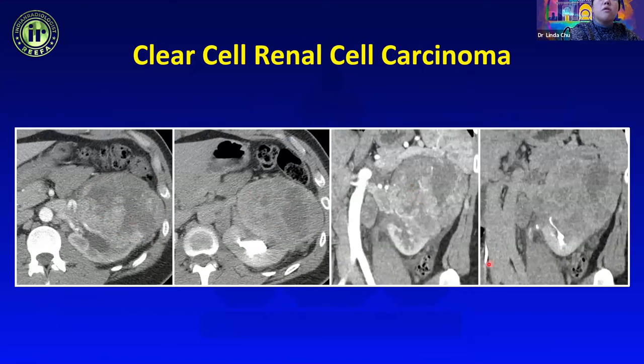Another case demonstrates primarily a peri-renal growth infiltration pattern, and a further case shows bilateral involvement with extensive peri-renal growth and soft tissue infiltration throughout the retroperitoneum — lymphoma and metastatic disease are good considerations. When seeing a peri-renal infiltrated growth pattern, think about lymphoma, retroperitoneal sarcoma, extramedullary hematopoiesis, lymphatic malformation, retroperitoneal fibrosis, and hemorrhage — essentially anything that can infiltrate the peri-renal space. This particular case proved to be Erdheim-Chester disease.